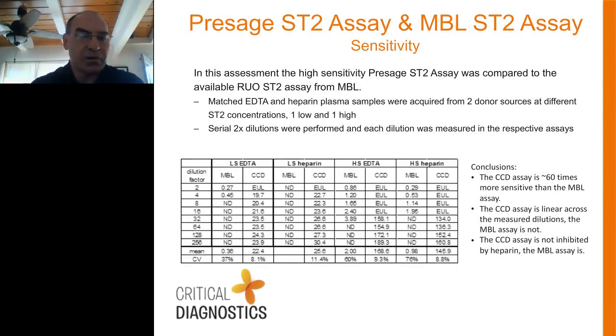Now, when we were evaluating our reagents, and we picked our reagents, one was for performance, but also for control. If we were going to build a test, we had to make sure that the reagents that were going into our test, because we are the manufacturer of record, were consistent in quality over time, and that we could defend the production of this test to go into the market.